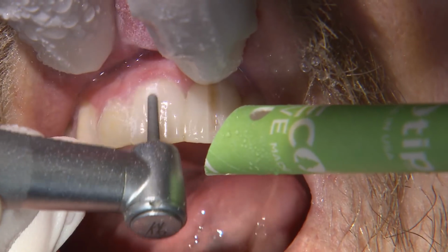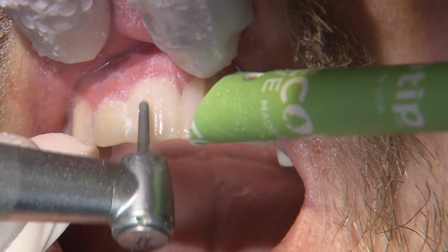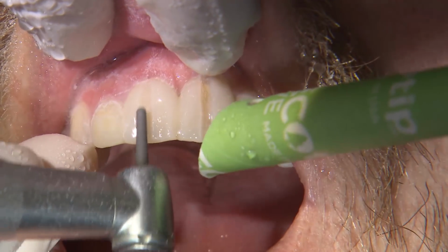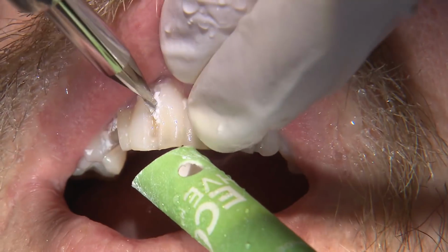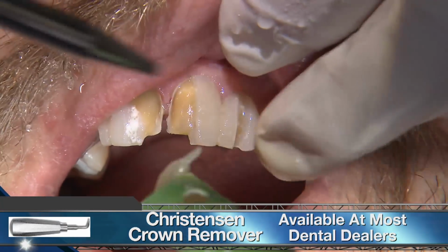When it comes time to removing the temps, I place vertical depth cuts until the acrylic is thin enough where I can see the color of the preps showing through. I avoid cutting entirely through the provisionals with the high speed so I don't inadvertently mutilate the preps beneath. When the material is thin enough, I twist with the Christensen crown removal tool until it breaks the temps apart for a quick removal.